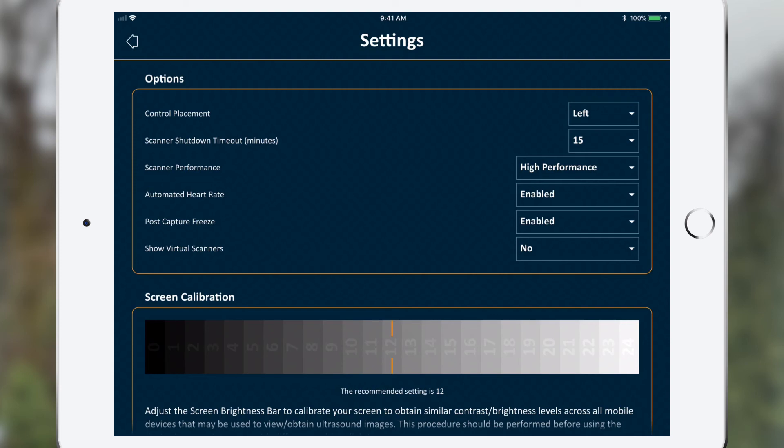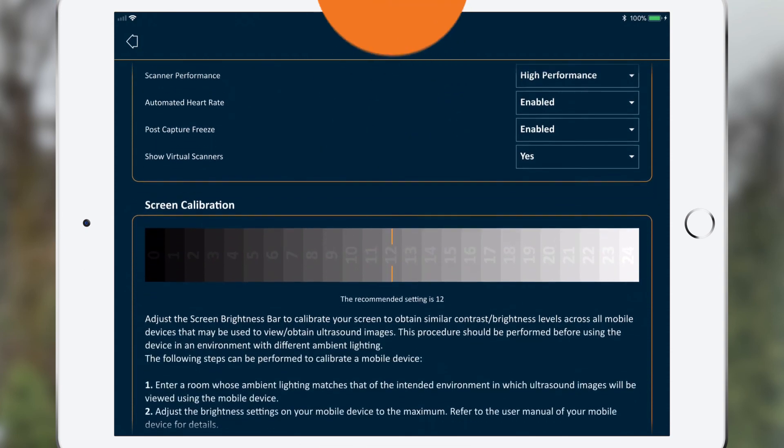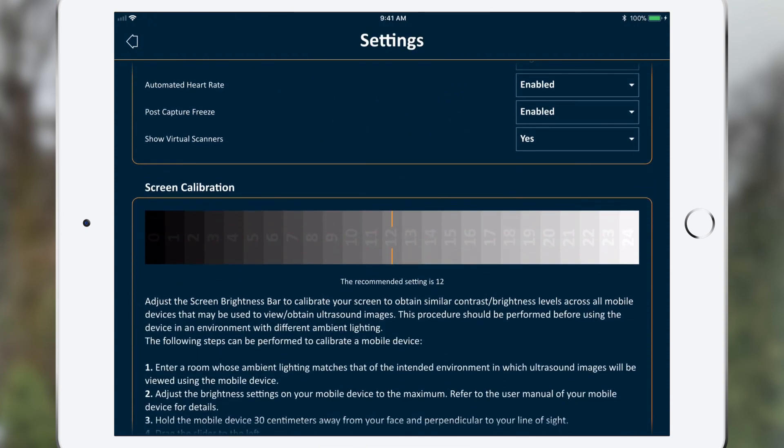If you want to demonstrate how Clarius works when you don't have your scanner with you, set the Show Virtual Scanners option to Yes to see our demo scanners on your app. To change the overall brightness and contrast of your image, adjust your screen calibration. This setting will not affect your other apps.